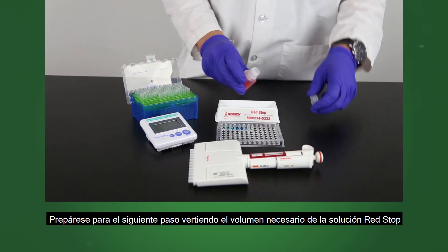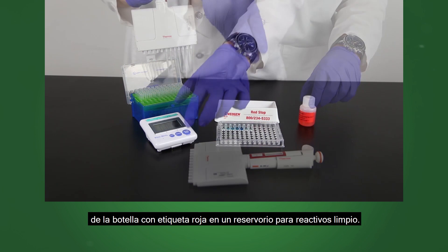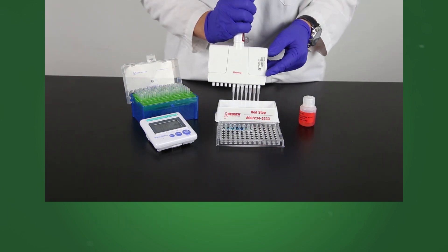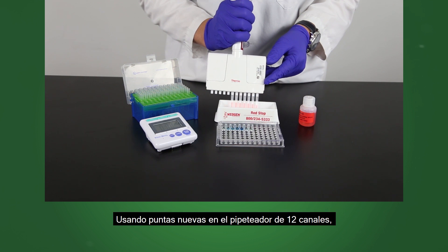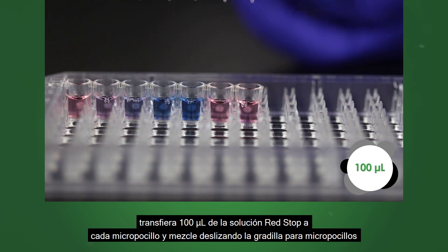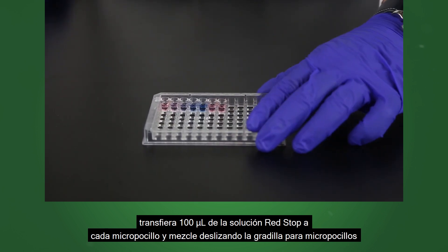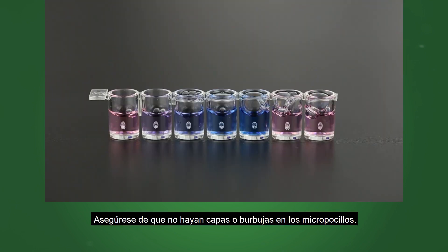Prepare for the next step by pouring the needed volume of red stop solution from the red labeled bottle into a clean reagent boat. At the completion of the incubation, do not wash the wells. Using new tips on the 12 channel pipetter, transfer 100 microliters of red stop solution into each well and mix by sliding the microwell holder back and forth on a flat surface. Make sure there is no layering or bubbling in the wells.